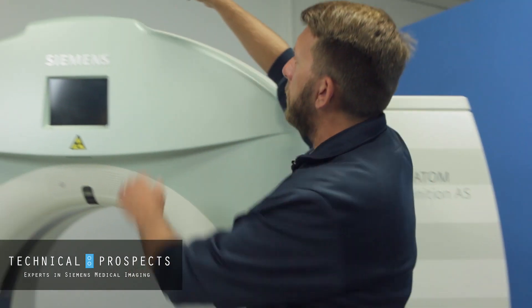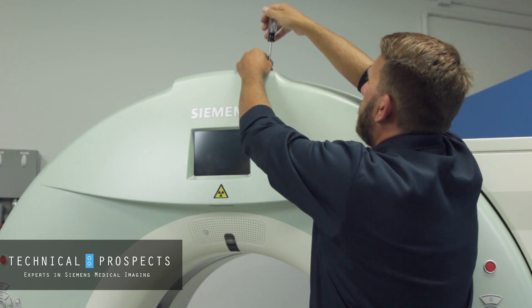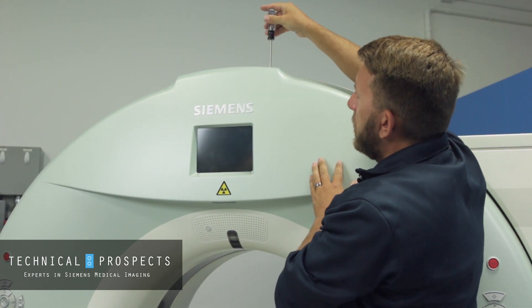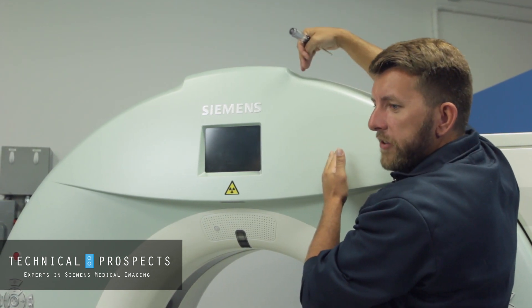The last screw is on the top middle above the display. You'll have to feel up there if you don't have a ladder. This one only turns about a half turn — once you feel it stop, that's it. What that really is is just an extra hooking latch.